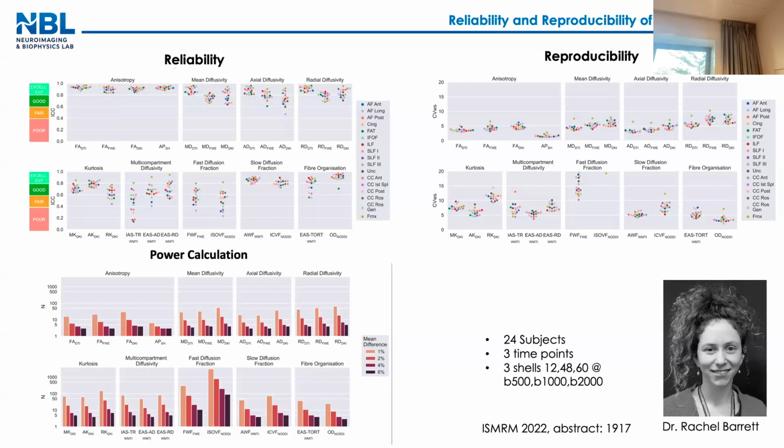So by using the most advanced model, it's not necessarily always the best thing to do. You need to be balanced between the quality of your data and what the research question is. So for example, I'm still a big fan of the DTI and diffusivity FA because they are extremely sensitive. If I have a strong hypothesis, I don't need to separate the different tissues and the sensitivity is there, I'll go with the DTI. But if I need a little bit more to understand exactly where this change is coming from, yes, I need to go for a higher model, okay? Not necessarily bigger is better or more complex is better.